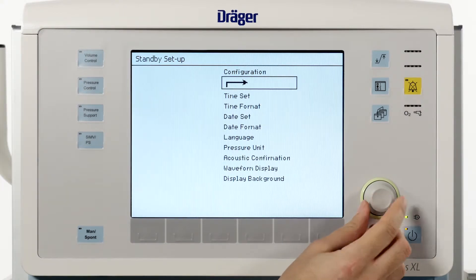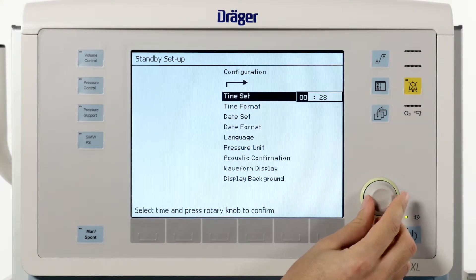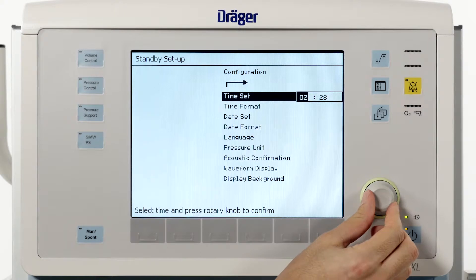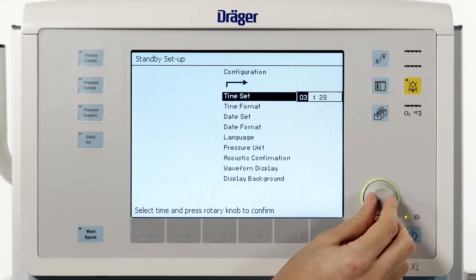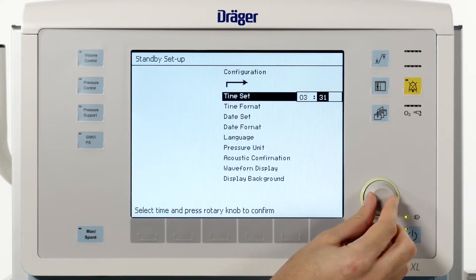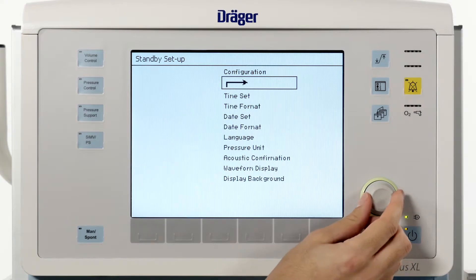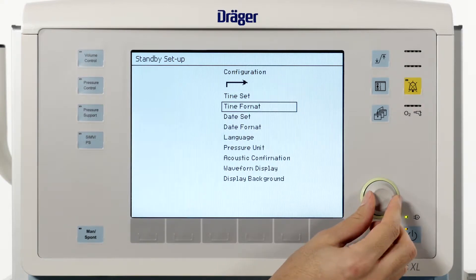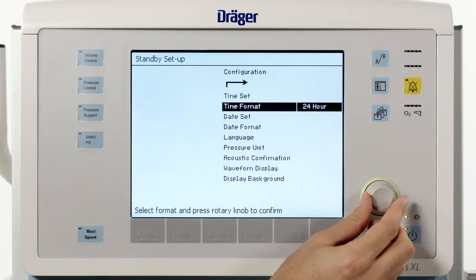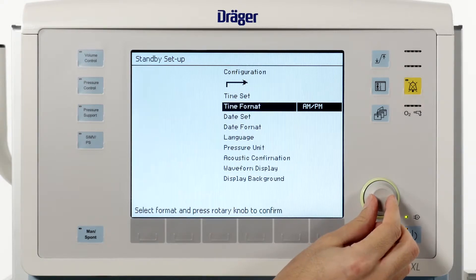The menu point time set allows you to adjust the Fabius's clock. Simply turn the rotary knob to change the values and press it to confirm. Under time format you are able to choose between a 24-hour format or AM/PM as time format.